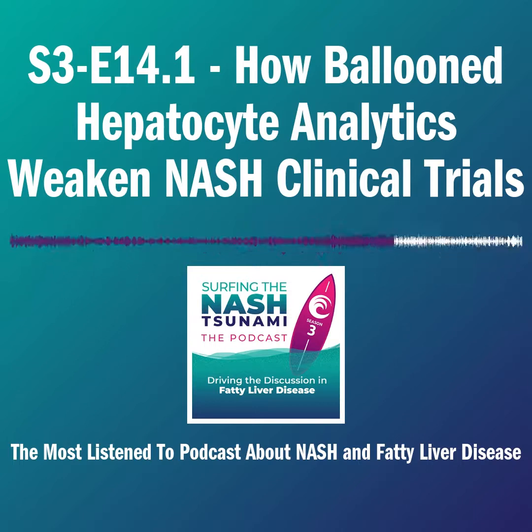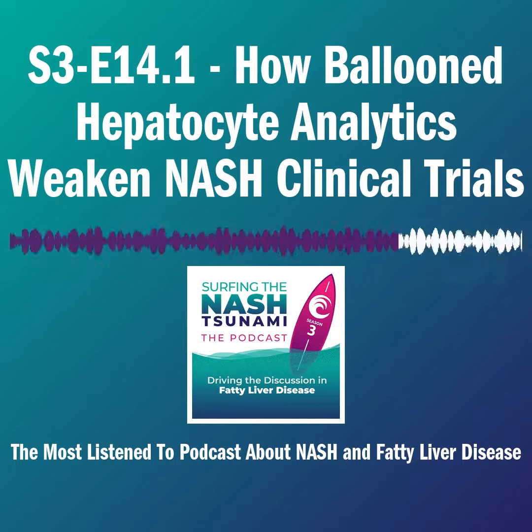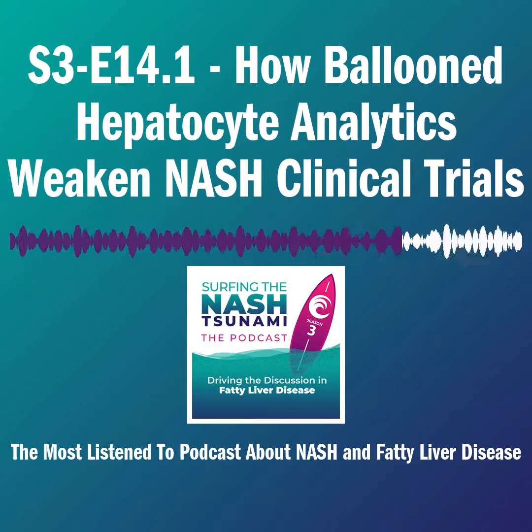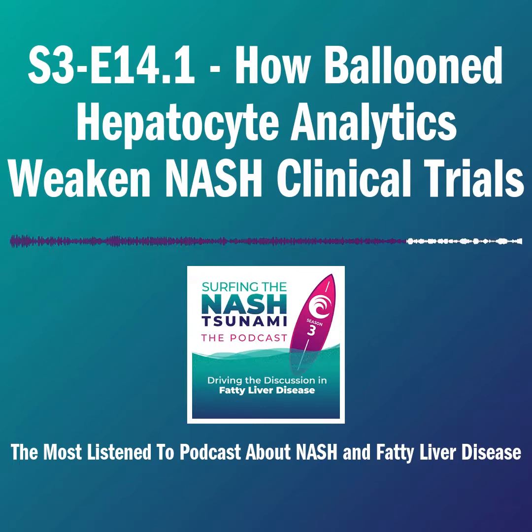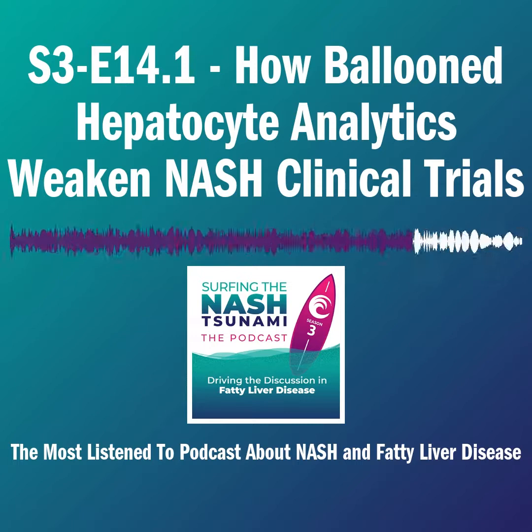But let me ask you this, taking this forward into how we can use this technology to improve drug development, do you see a situation where we can look at the volume change in ballooned hepatocytes and link that to a change in fibrosis per se? So Q ballooning, Q fibrosis, kind of collinearity, if you will, just like we've done with Q steatosis and Q fibrosis. Is there a way we can now take this technology into drug development and look at pre and post liver biopsies and maybe say, you don't have to get rid of all ballooning, we just have to show a reduction in a percentage or something like that?